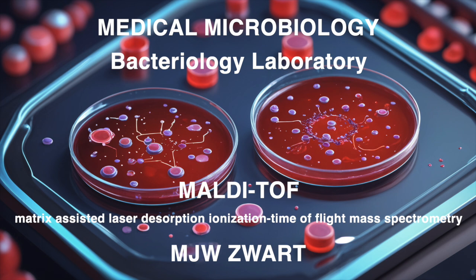With the BTS, it's all about precision. Yeah. And protecting those precious proteins from damage. The document really stresses handling it carefully to prevent oxidation, which could totally affect its performance. No vigorous shaking or vortexing allowed. Wow. It even says to avoid creating air bubbles during pipetting. They really aren't messing around with this gentle handling.